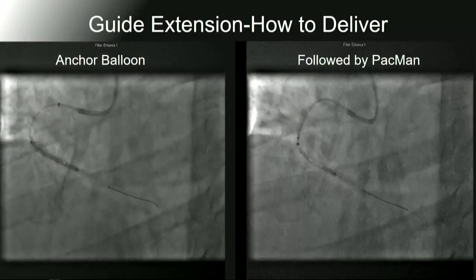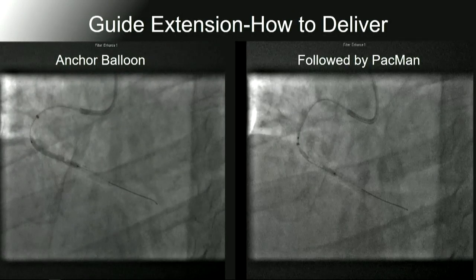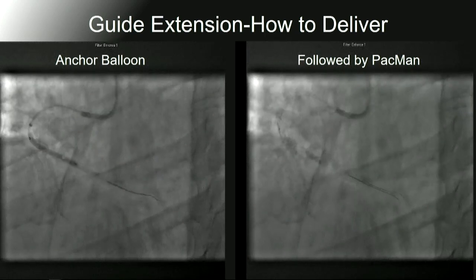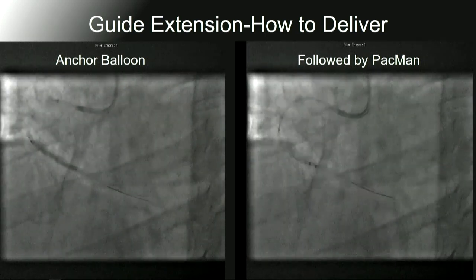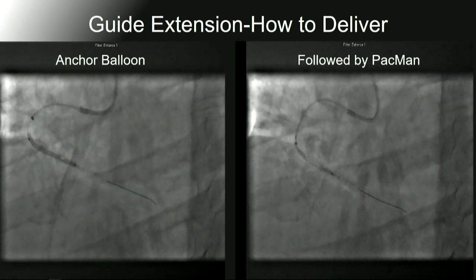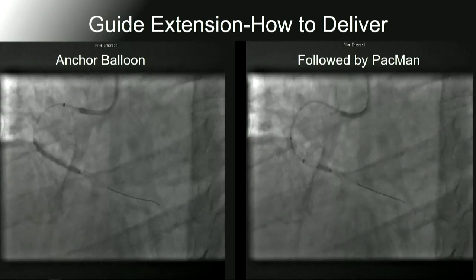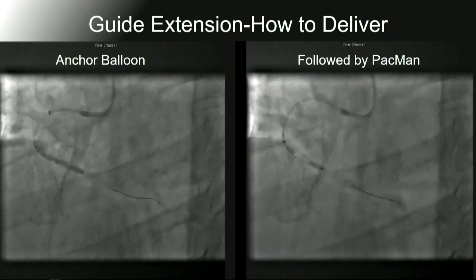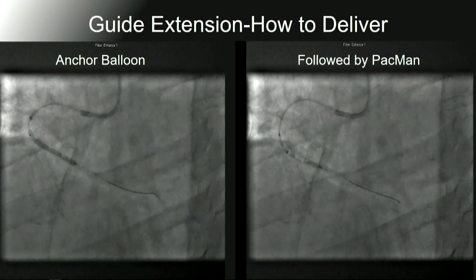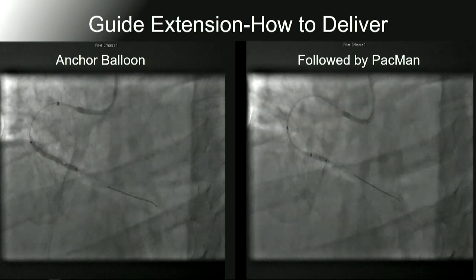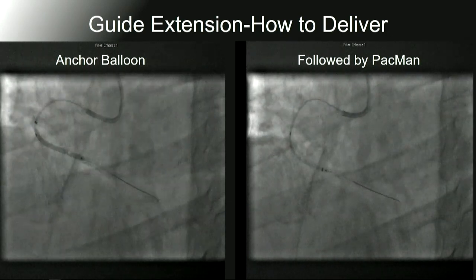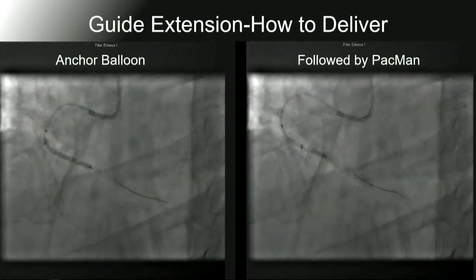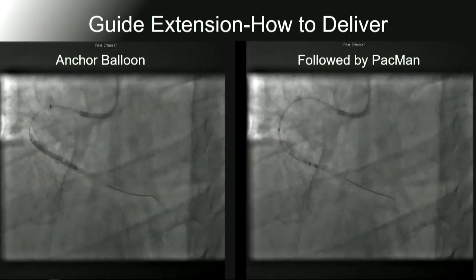This is another example with a right coronary artery where we already placed a stent distally. We're now using the stent balloon as an anchor to advance the GuideLiner down the vessel to place the next stent. This is the anchor balloon technique. As you get closer to the balloon, deflate it slowly — don't go fully negative. Go slowly on the inflator to allow the balloon to collapse, and advance your GuideLiner as the balloon collapses.